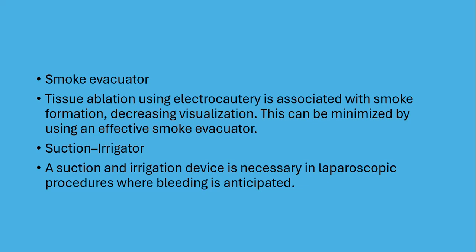Smoke evacuator. Tissue ablation using electrocautery is associated with smoke formation, decreasing visualization. This can be minimized by using an effective smoke evacuator. Suction irrigator. A suction and irrigation device is necessary in laparoscopic procedures where bleeding is anticipated.